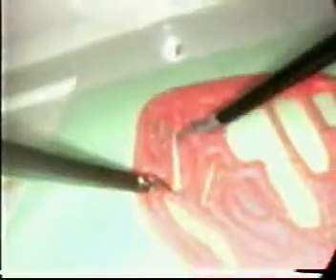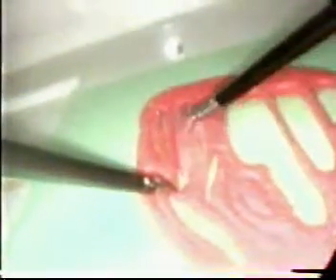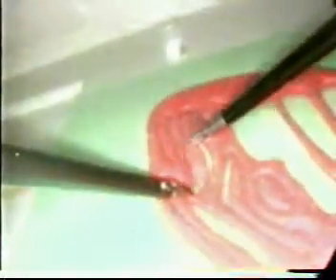Now place the foam tree inside the simulator. Use a combination of graspers and scissors to dissect out a portion of foam. This is another useful exercise in the manipulation of instruments.